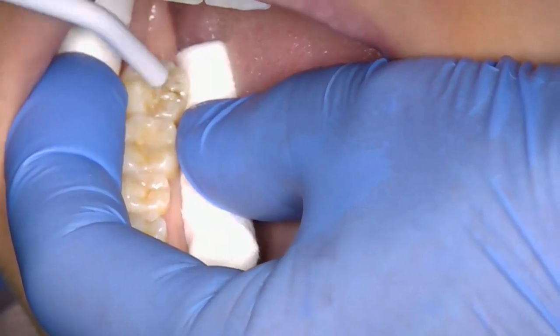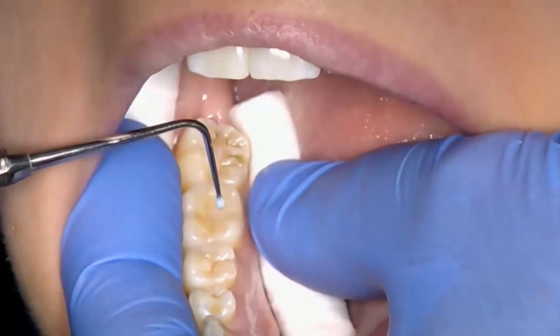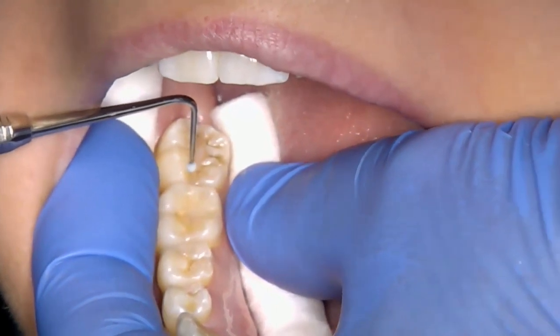The tooth fissures should now have a glossy appearance. Light cure the bond for 20 seconds, placing the tip of the light as close to the tooth as possible without touching it. The orange safety shield must be used to avoid damaging eyes with the bright curing light.